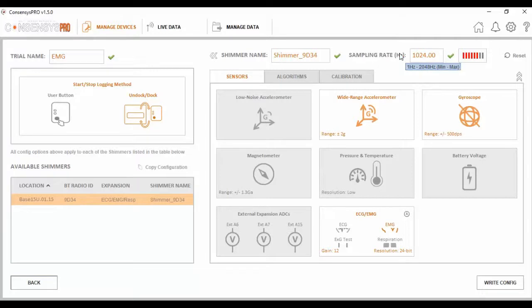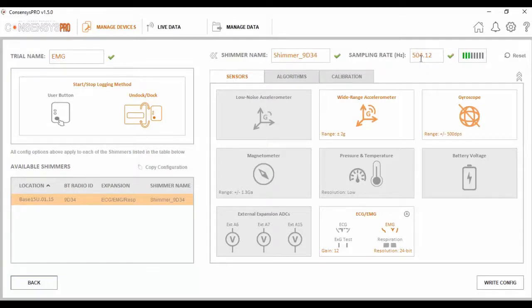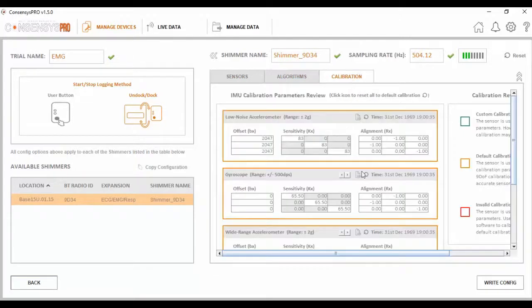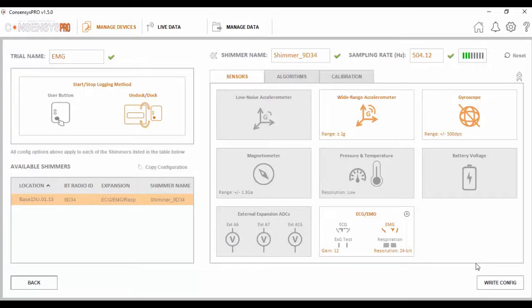The sampling rate can also be set at this point. The sampling rate can be set from a minimum of 1 Hz to a maximum of 2048 Hz. For the purpose of this video, let's set the sampling rate at 500 Hz. This is done by inputting into the box and pressing enter. We can also add algorithms to this trial if we so wish. The final tab to consider is our calibration settings. At this point, if I'm happy with the sensing signals I've enabled and the various other settings, I can write these settings to the Shimmer by pressing write config down here.